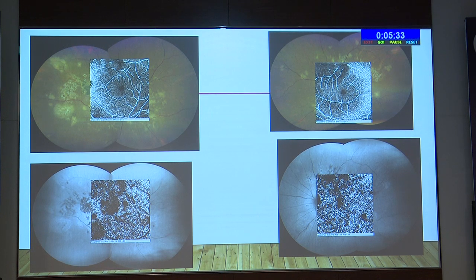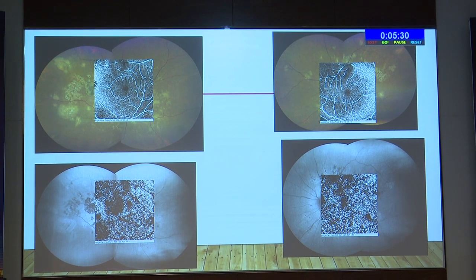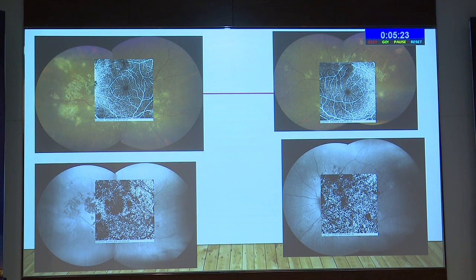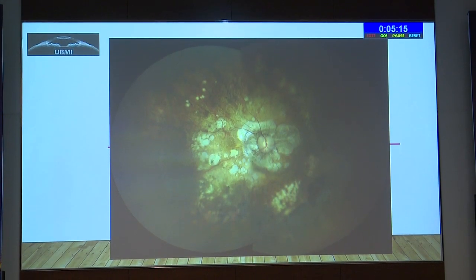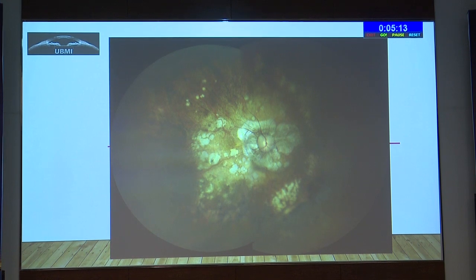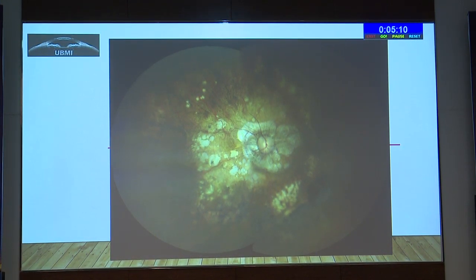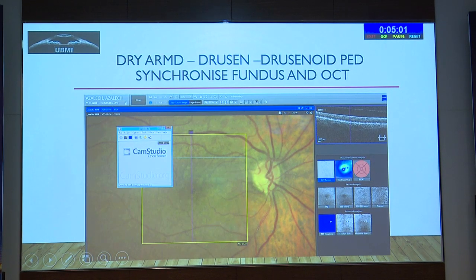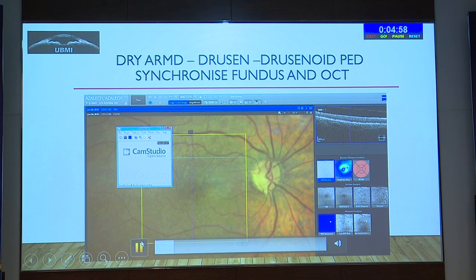The importance, in the next few minutes, is to have the Forum software, where you can overlap the OCT, the angio, and the fundus on one picture, and have one-to-one correlation. But it's not possible on the machine; it's on an external server. Now this patient was a myopic patient with an axial length of around 37.5 millimeters, such a high myopia, staphyloma. We could see the posterior pole quite well on this. So here, just see this video. We have these images outside.